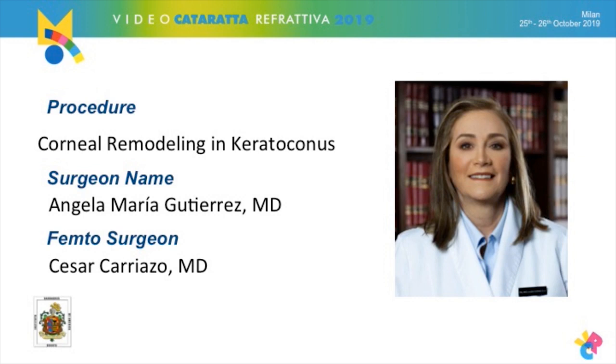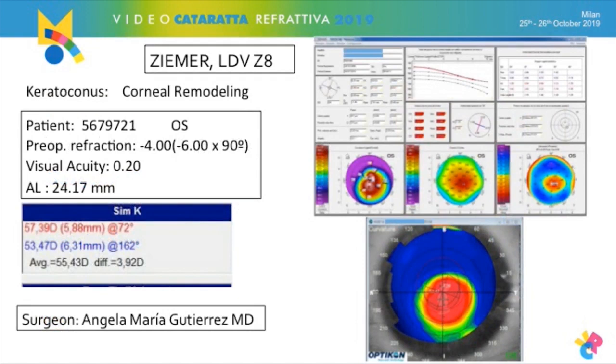Now we have the second case. The surgeon will be Dr. Angela Gutierrez, Chief of the Department of Cataract and Refractive Surgery of the Clinica Barraquer Institute. And the patient is 18 years old, female, and has a keratoconus grade 3.